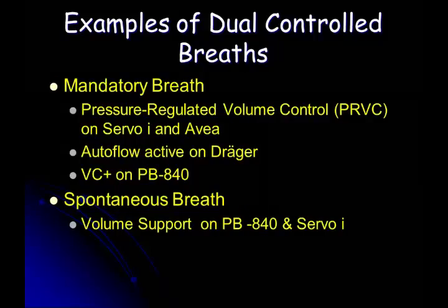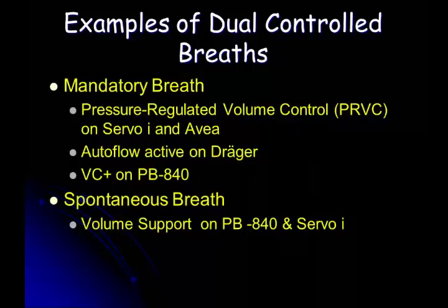These are dual modes. These are modes where I'm targeting a tidal volume and it's altering a pressure level on its own to get that tidal volume delivered. Okay. These are dual modes.